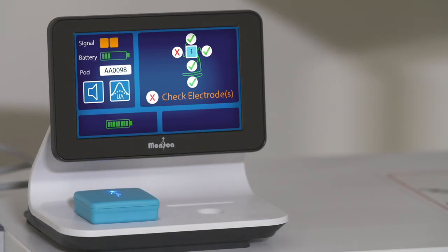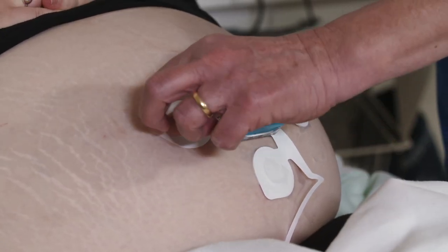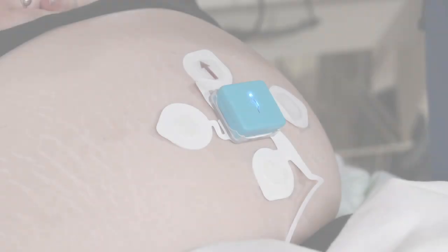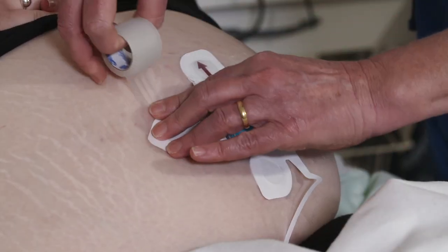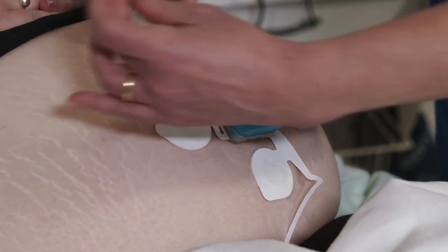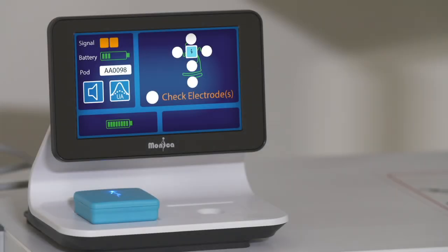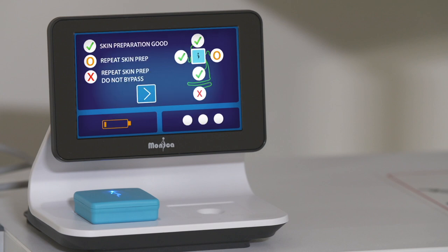If it is only one electrode, the Novi display will alert you as to which electrode has become detached. Locate the detached electrode and stick it back down over the same spot and secure with micropore tape. When more than one electrode has become detached, the pod is unable to determine which electrodes are at fault and you will need to investigate all the electrodes to locate the problem. Alternatively, you can end the monitoring session and start again — the skin electrode check screen will then identify the problem electrodes.